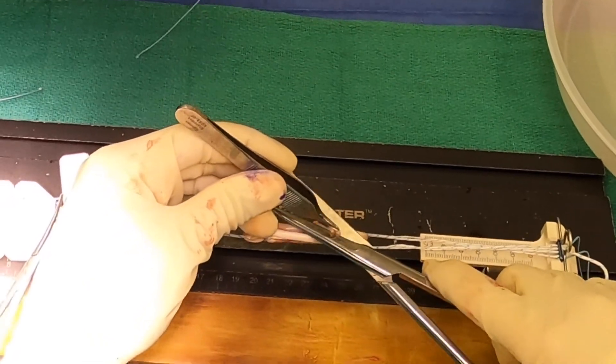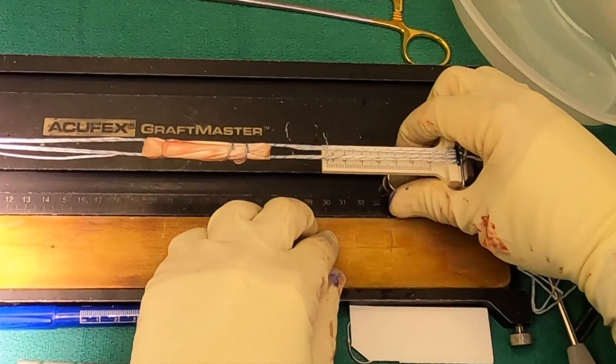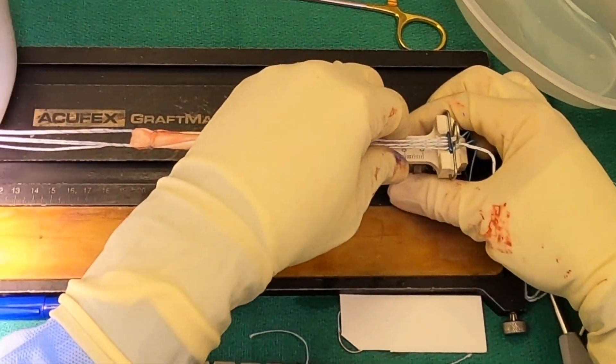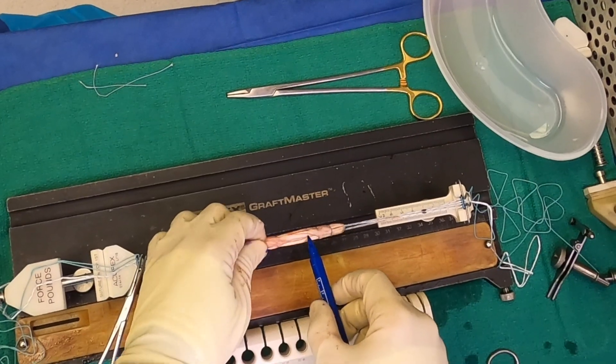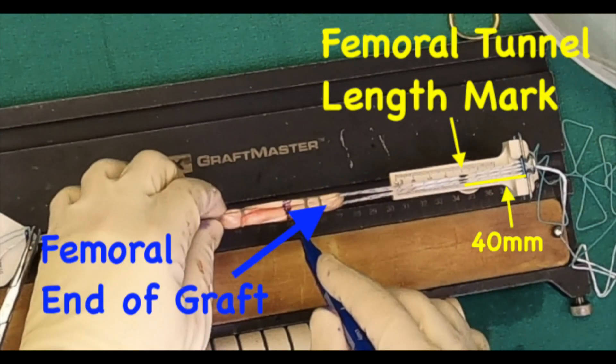Our next step is trimming any loose ends, making sure it's nice and smooth. Measure your graft to make sure you have at least 60 millimeters, check your diameter with your preferred method, and then tension it — typically to about 10 pounds; there might be a little more creep in the system and you want to get that out. I now mark it somewhere around the midpoint. Once you drill your femoral tunnel, you can mark it — for example, if it's a 40 millimeter tunnel from the button down to the suture — so that when you draw the suture up into the femoral tunnel you can see that mark at your aperture in the joint and know to flip the button and start to tension the graft and draw it into the joint. I hope this was helpful.